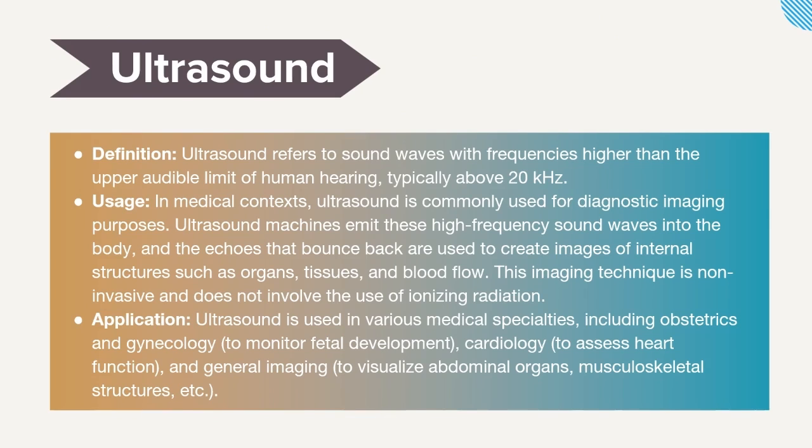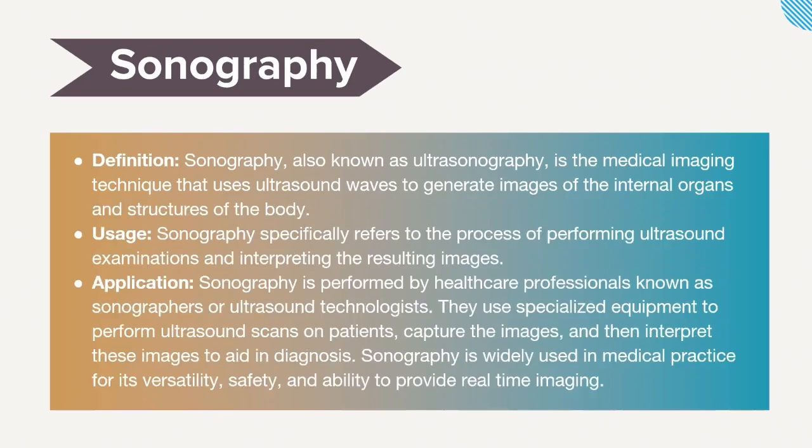It is used in various specialties, particularly obstetrics and gynecology, to monitor the baby's fetal development. It's used in cardiology for heart function and general imaging of abdominal organs, muscle structures, just problems and issues that you need to be able to see internally that other testing systems may not be able to visualize.